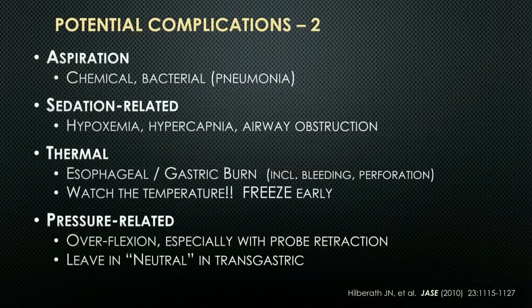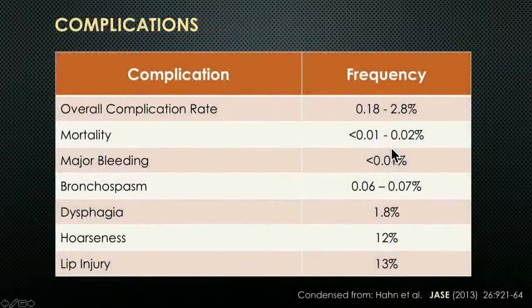And that can lead to perforation. So if you're not using your probe during a surgery or during a procedure, it's best to advance into the transgastric view and leave the probe in a non-anteflexed and non-retroflexed position.